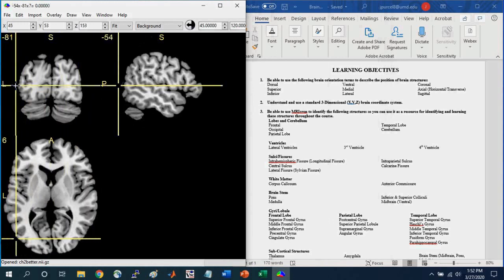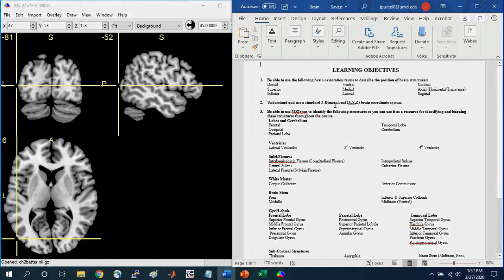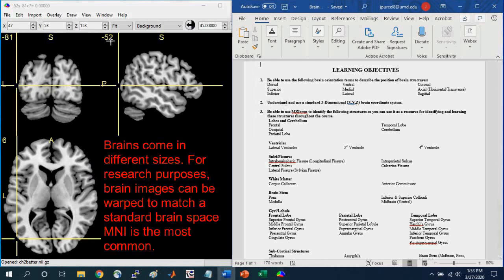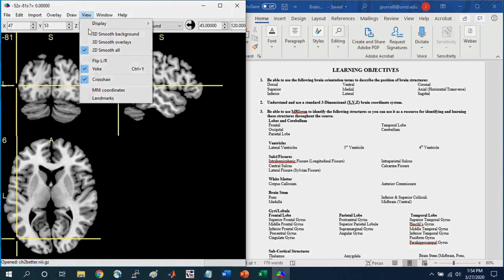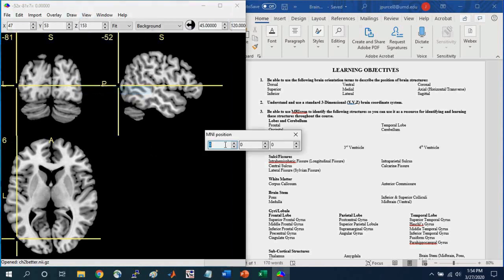Next, it's important to understand the XYZ coordinate system. You may have noticed these numbers up here — these refer to the XYZ coordinates in standard brain space. The specific brain space we're talking about is MNI space, Montreal Neurological Institute space. This is a standard coordinate system used all over the world, such that if somebody on the other side of the planet gives me a coordinate in MNI space, I know exactly what part of the brain they are looking at. We can navigate to a specific coordinate by going to View, MNI Coordinates, and inputting the XYZ coordinate. By default, it takes us to the 0, 0, 0 point — the very center of this standard coordinate system.